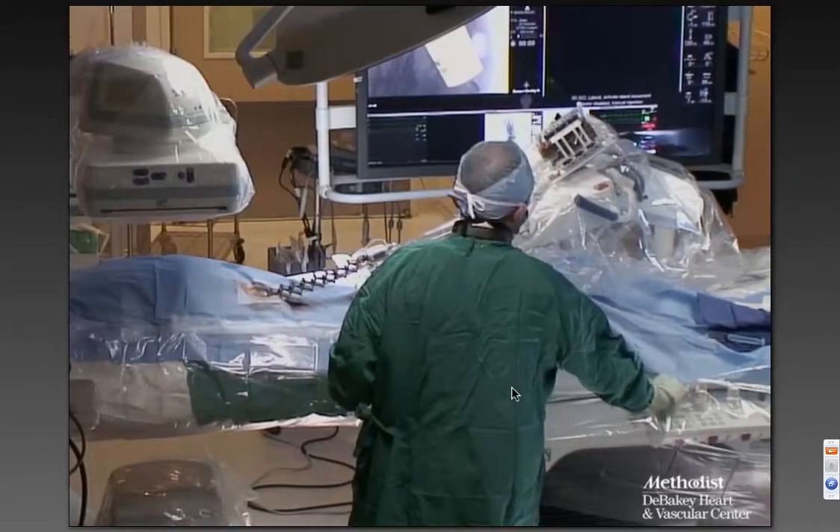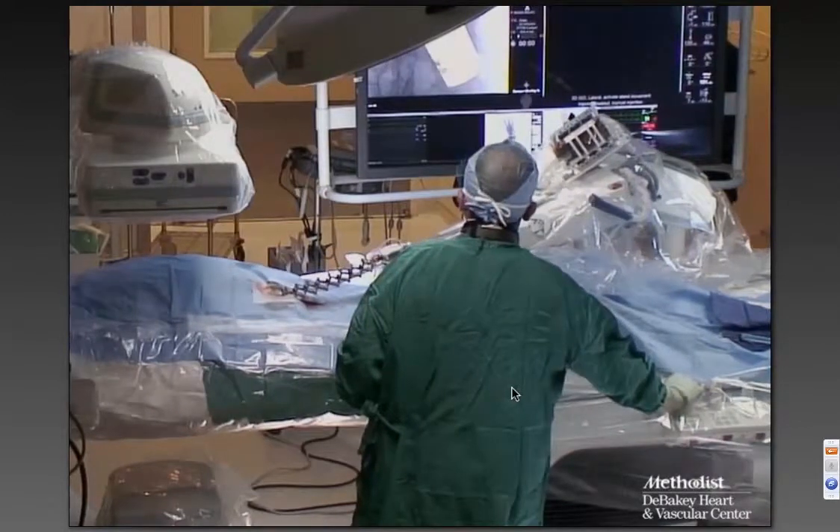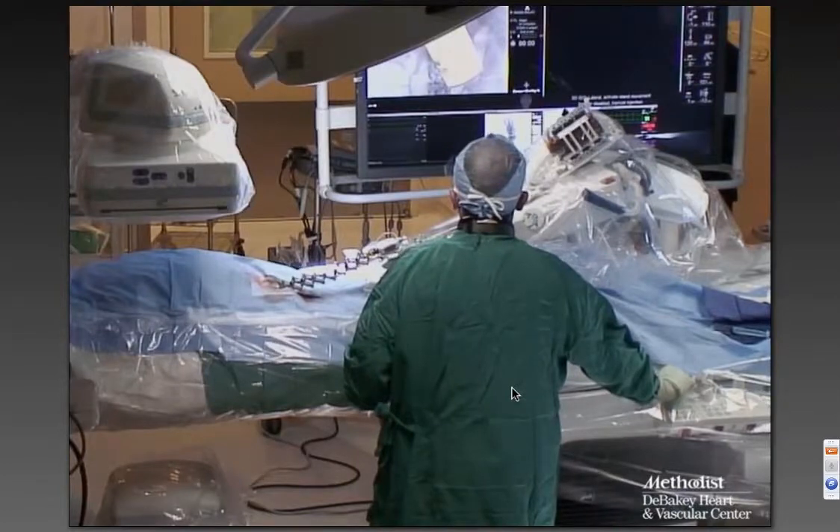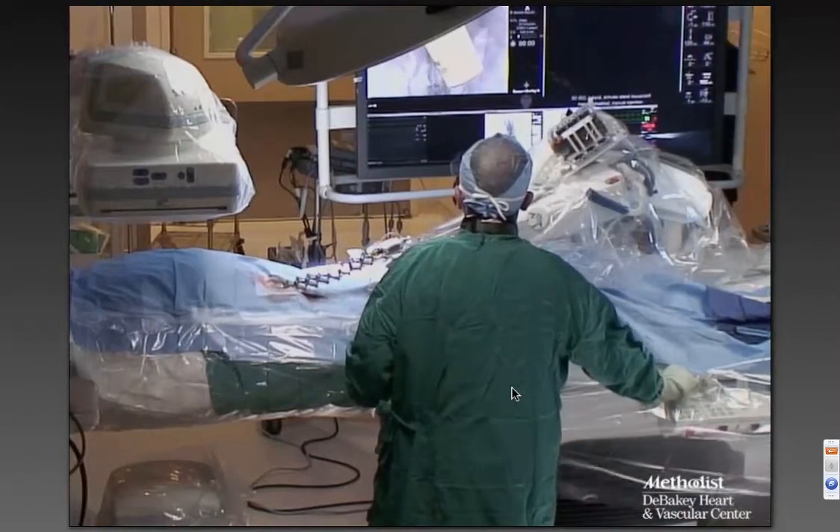At that point, we opted to bring in the robot. This is our clinical hybrid room — this is the setup — and the robot is attached to the bottom left of the float table.